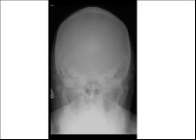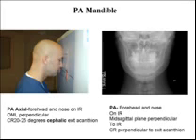nasion. Suspend respiration. PA mandible or PA axial projection of the mandible. Rest the patient's forehead and nose on the grid. Tuck the chin. OML is perpendicular to the image receptor for the rami. Central ray to exit the junction of the lips. PA axial is used for an elongated view of the condyloid processes. Central ray angle 20 to 25 degrees cephalad, exiting the acanthion. True PA for the body, raise the chin to bring the acanthomeatal line perpendicular to the image receptor.